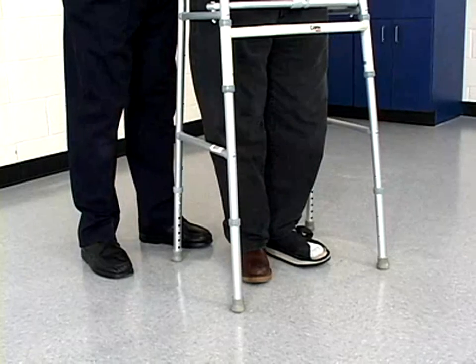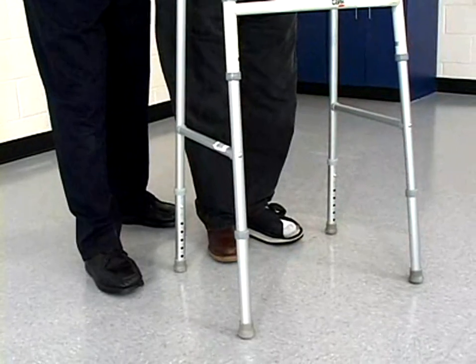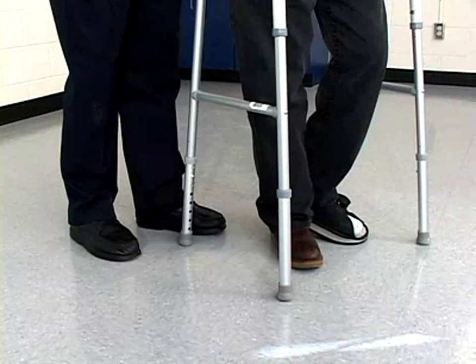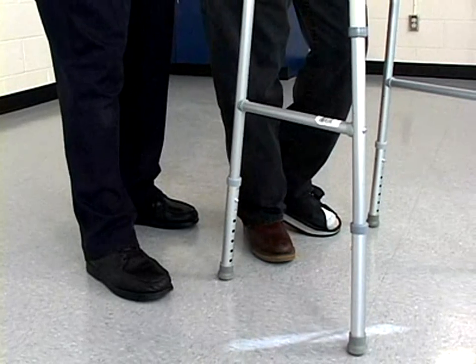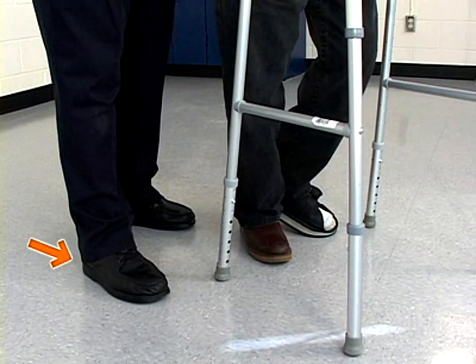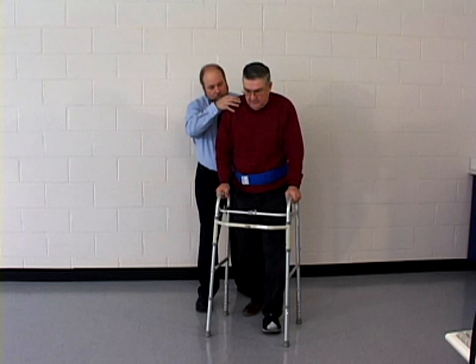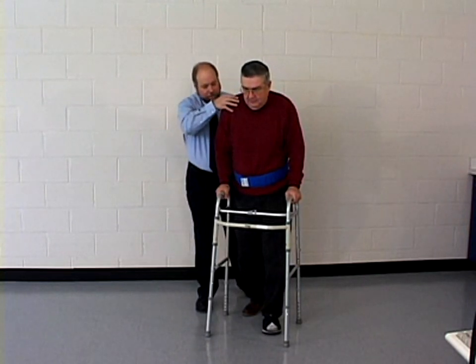The walker is lifted and advanced forward. All 4 legs of the walker must be lifted from or lowered to the floor simultaneously. As the patient moves the walker, the therapist advances his right or outside foot. The patient then advances the involved lower extremity, moving into the strength and stability of the walker. Then he bears weight through his upper extremities as he advances his uninvolved lower extremity.